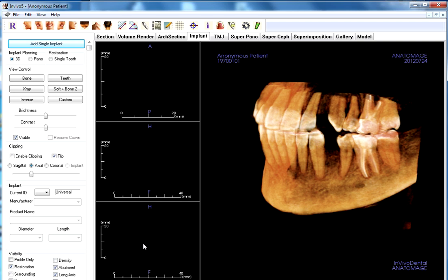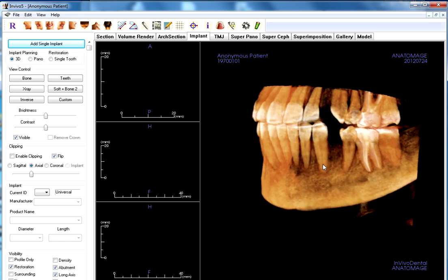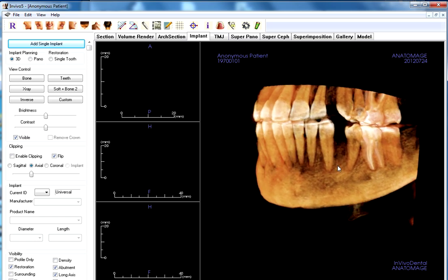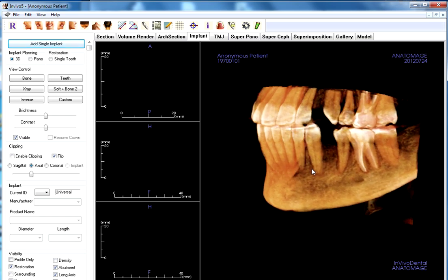With this case, we're going to be placing an implant in the tooth number 21 position. We're utilizing the InVivo 5 software. And let's just get started with placing an implant.